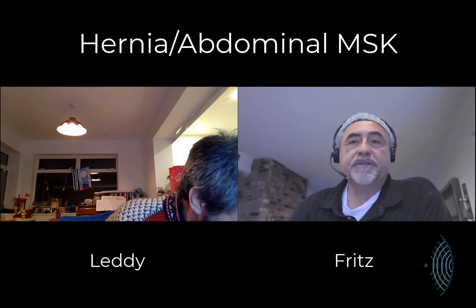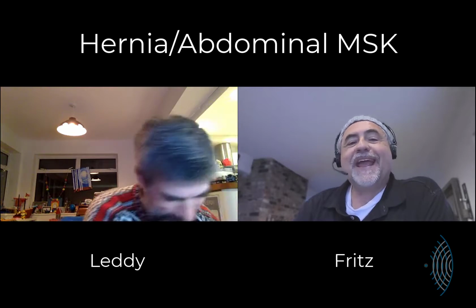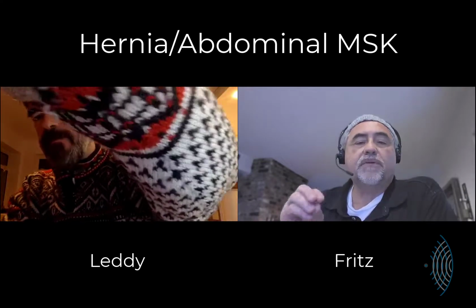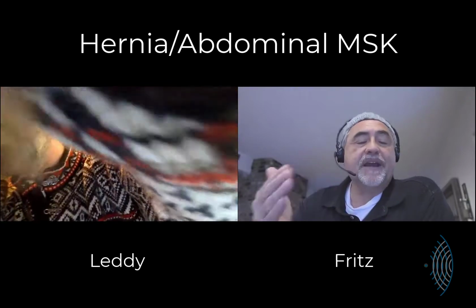What you need to look for is that he overexerted his oblique muscles, so your eyes should be above that white line. When your eyes are evaluating the cross-sectional area of the gut, you'll know you see a hernia if that white line becomes at all compromised when they bear down. Let me just listen to you, because I have dynamic images.